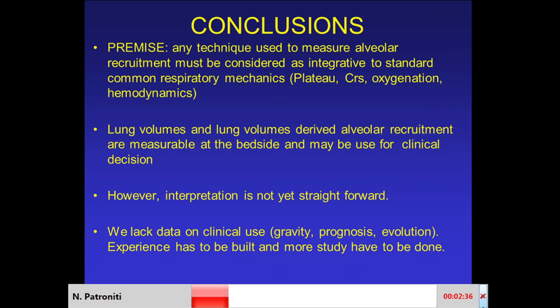I go to my conclusion, starting with the premise that I already told you, that any special technique must be integrative of standard respiratory mechanics knowledge. Always, you will rely always on that. Is it feasible to measure lung volumes? Yes, it's feasible, but you need the machine. I hope that more ventilators will try to have something similar. But the interpretation of the result is not so straightforward.